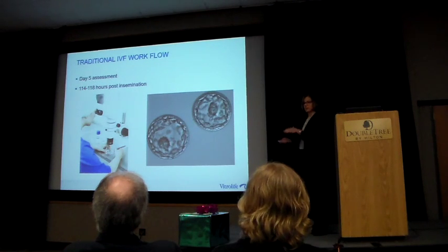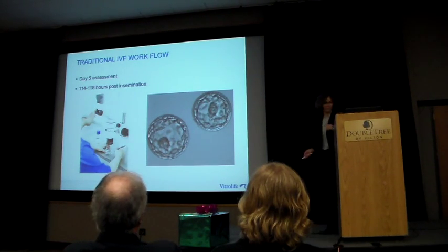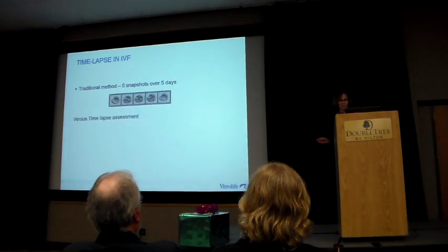In the old system, the only thing we would do, we could see this end result picture, and we could go back to all the notes from the other days. And from those, that limited bit of information, we had to make selections. What embryo are you going to get back? We got really good at it. Really, really good at it. But just because we got good at it doesn't mean it was as good as we could get.